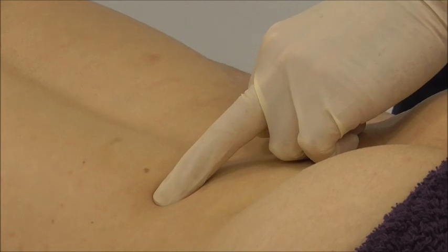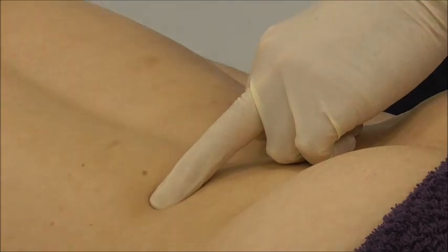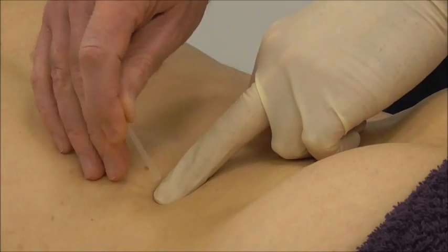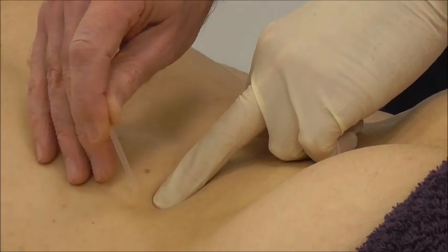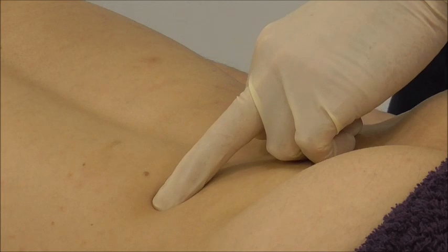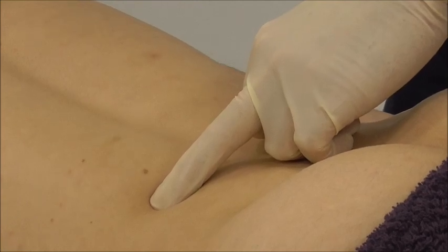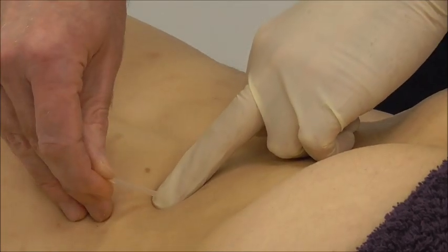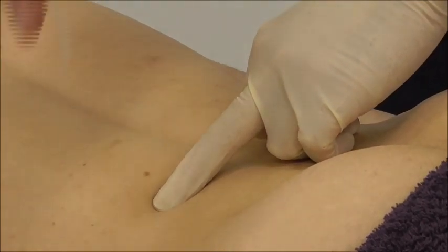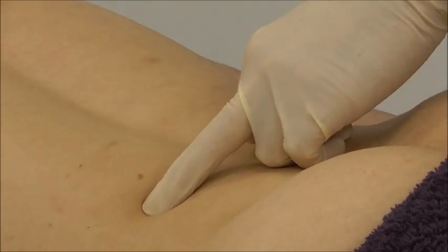I've used a 30mm needle, so I know I can't reach any deep structure — I can't reach the spinal cord or the kidney from this position. By angling the needle, I'm ensuring that if I had chosen an inappropriately long needle and pressed too far, the needle would strike bone, moving towards a safe position rather than potentially moving towards the kidney.